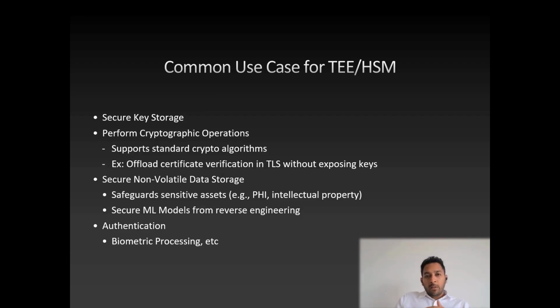Okay, let's look at some common use cases for this. The first primary use case is to store cryptographic keys securely, the secure key storage. So you can store keys for secure boot and keys for encryption securely in this secure storage. And you can also perform cryptographic operations securely. So it supports all major crypto primitives and also all crypto algorithms.